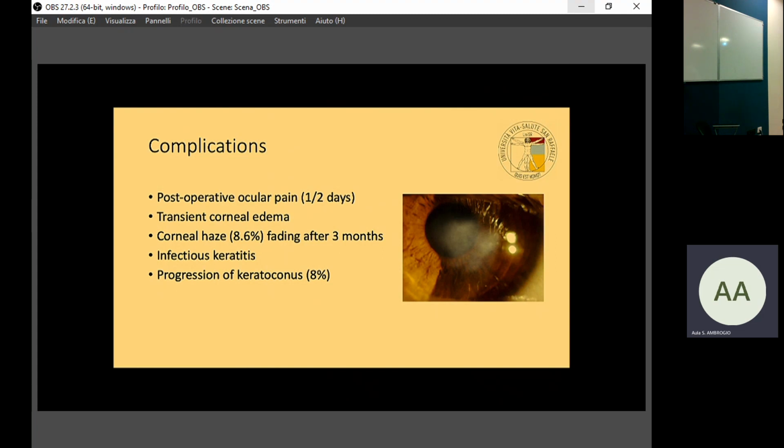And also remember that this kind of patient were leading to penetrating keratoplasty. So a really invasive procedure with an important morbidity for the patient. And this way we can block and arrest the evolution of the disease, providing also more time for the patient to avoid the progression. And also in the case of failure of cross-linking, it is possible to redo the procedure. So this is a procedure that can also be redone in this kind of patient.